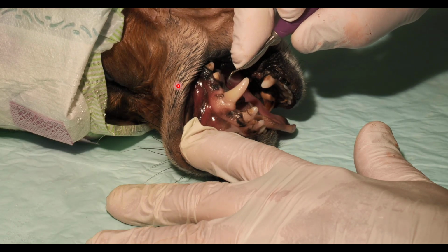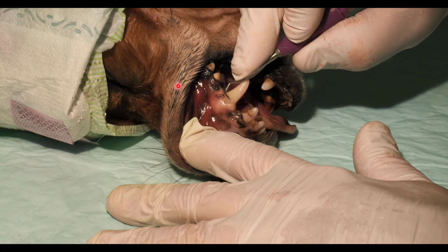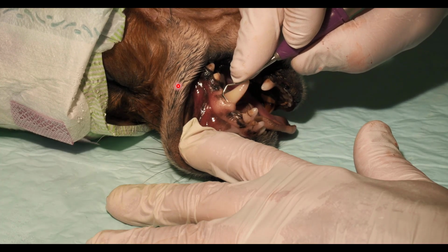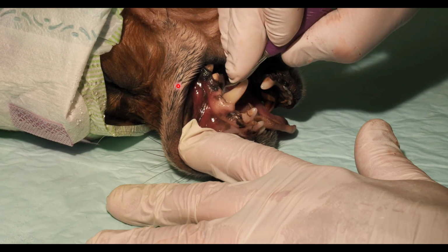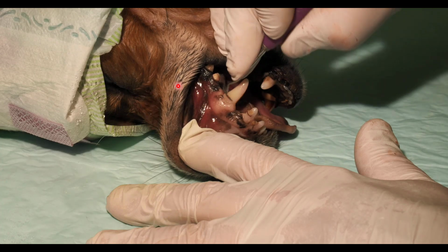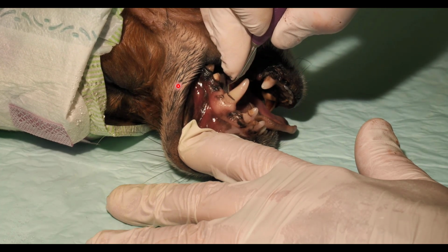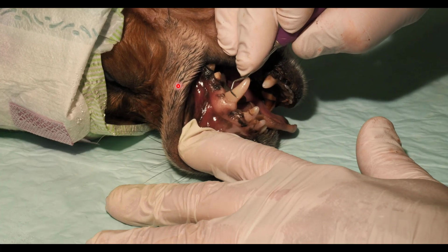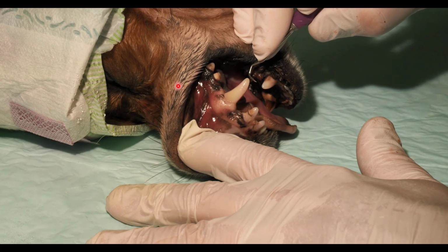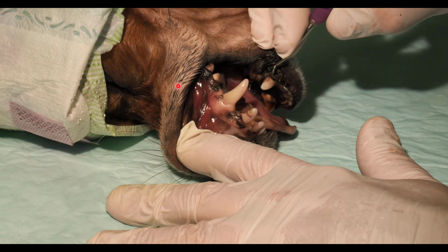One important point that I see people do is you may not supinate. One of the challenges people have is when they clean, they do this. They pull like that. When you do this, as soon as your instrument goes from here to here, you're not doing anything. You're just burnishing the calculus. So you need to make sure as you come through that you keep it parallel to the tooth surface. And then once it feels smooth, you're done with your supragingival cleaning.